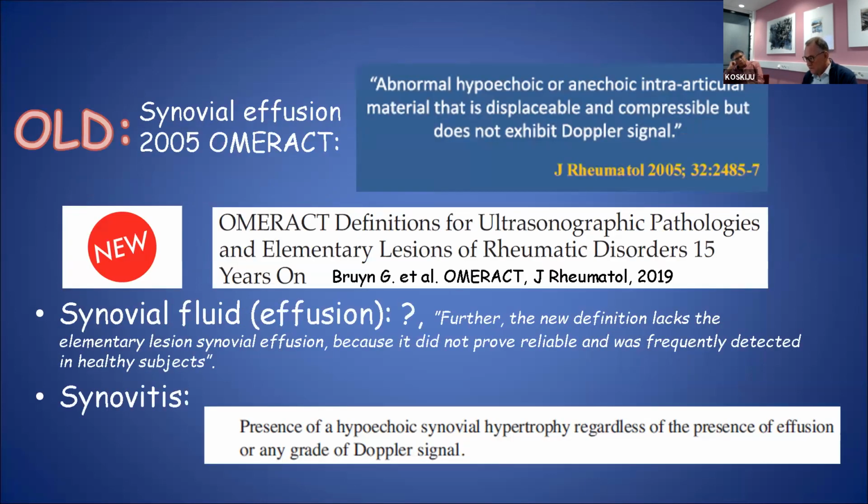OMERACT is an international organization that has produced several important definitions regarding the synovial, regarding the ultrasonographic phenomena. For example, what is effusion? It's abnormal, hypoechoic or anechoic material that can be displaceable and compressible. So it does not exhibit Doppler signal, as I just said in the last slide.